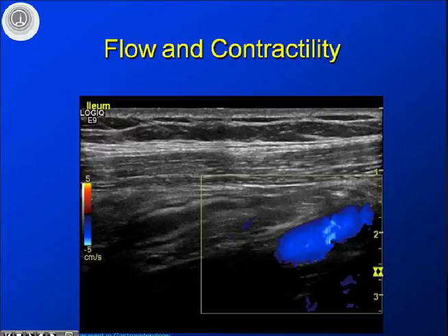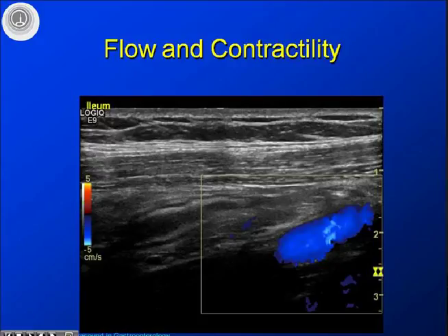In the same region, this is the Doppler of the iliac vessels and here is a portion of the distal ileum — you can see how it contracts. By combining Doppler with high-frequency ultrasound you can simultaneously study flow in vessels, flow in the GI wall, and how the distal ileum contracts. This is of course of high relevance in patients with Crohn's disease, for instance.